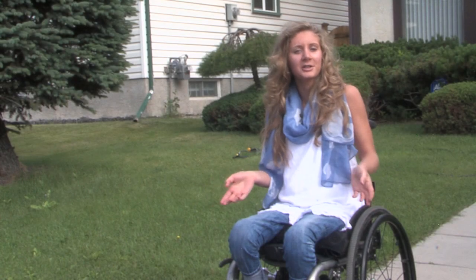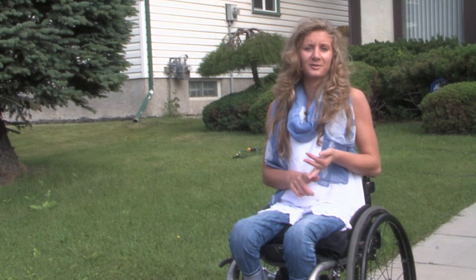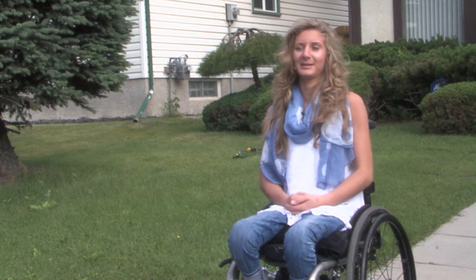It doesn't make your chair bulkier — it just adds a small wheel behind it. So I can still get through doorways in my house and at my friend's house. It's just like having a regular wheelchair except now I have a little bit of power mobility behind me.